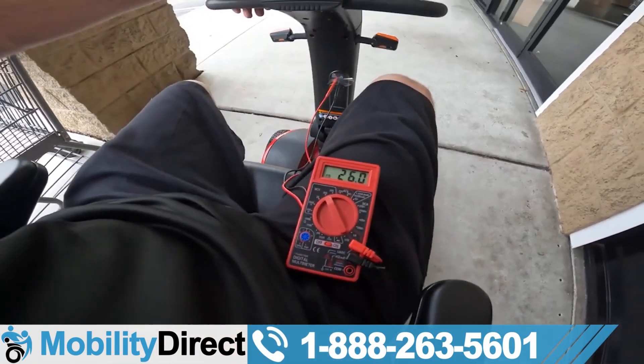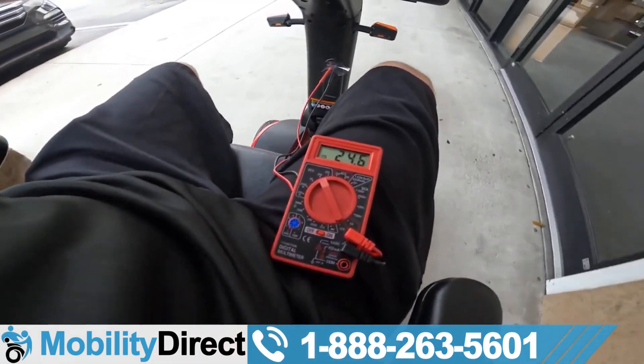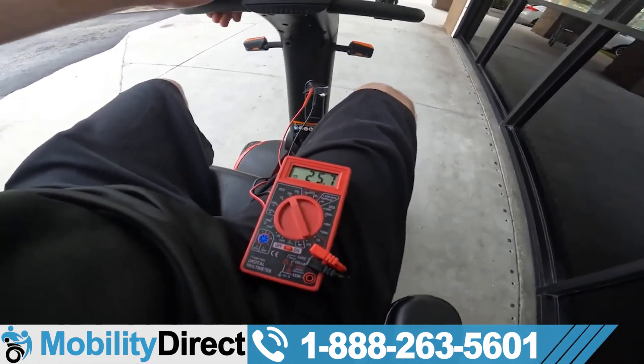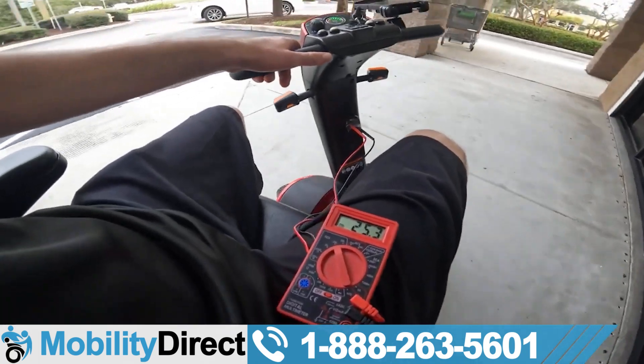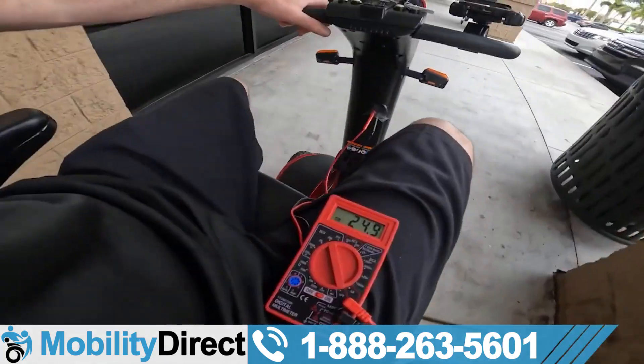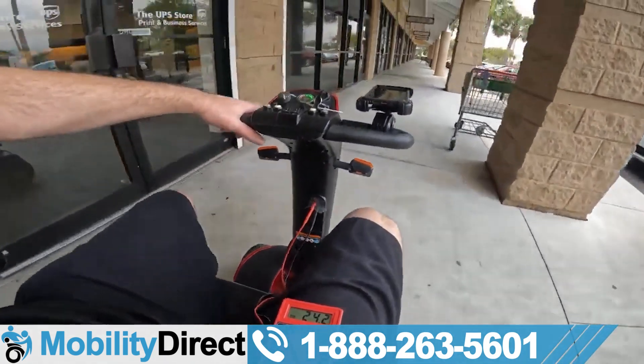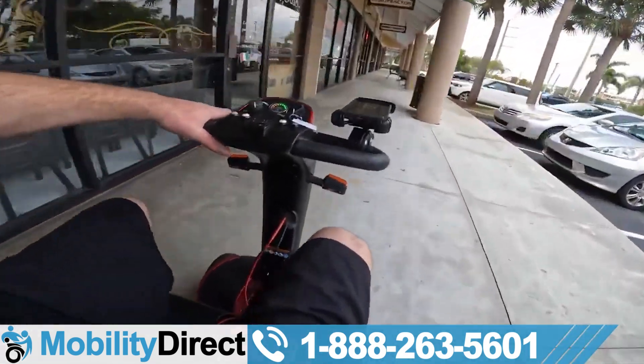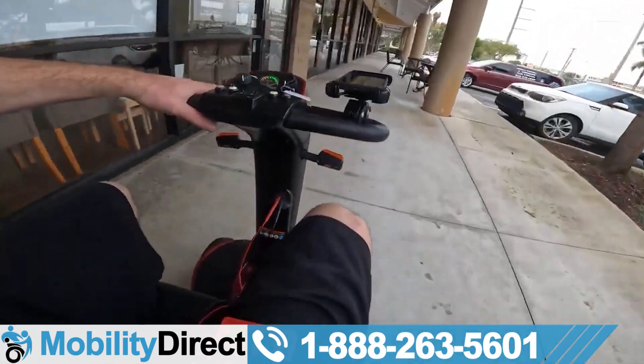One more time — 26 volts. We give it a go and it drops to 23.7. That's not good. Remember, it should be dropping gradually, not quickly like that. So we're going to bring this scooter back to the shop, give the customer a call and let them know — they should probably replace these batteries before they get stuck somewhere.